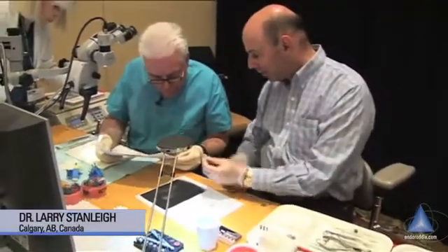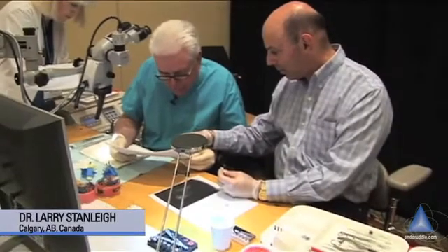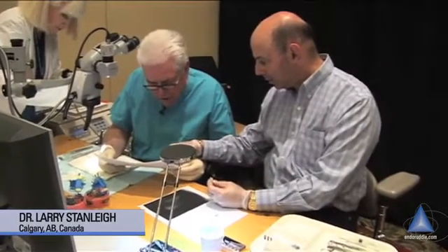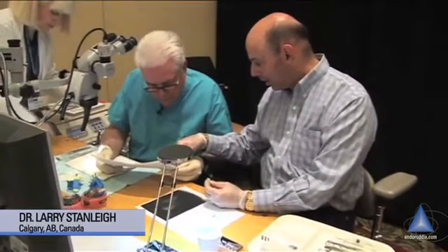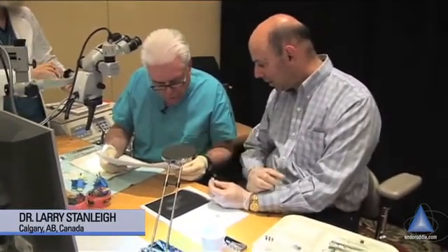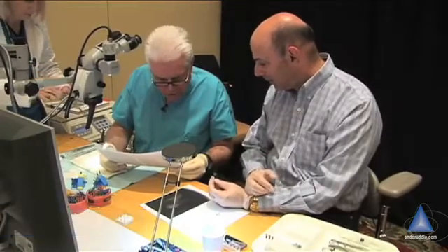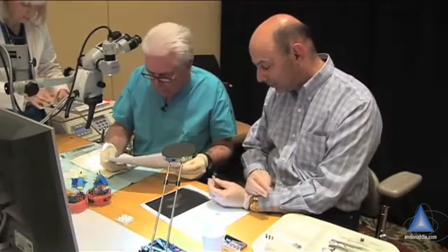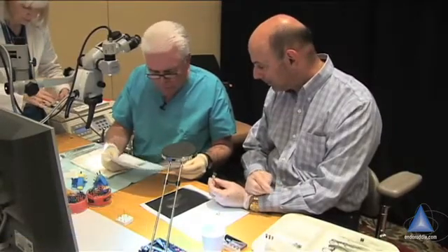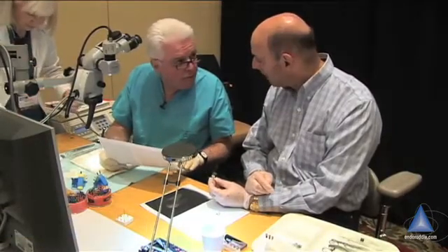On this tooth, I've got a post that I want to remove, and I've got a file that's stuck down there — a number 15 file. That one's going to be a real bear.